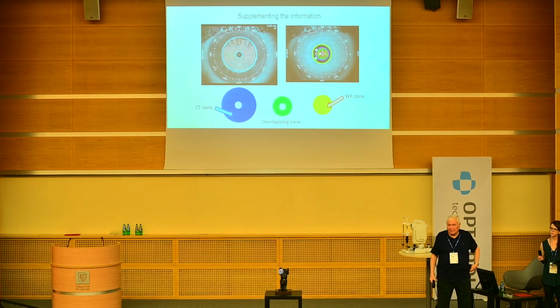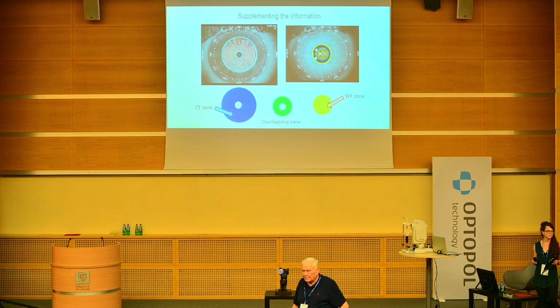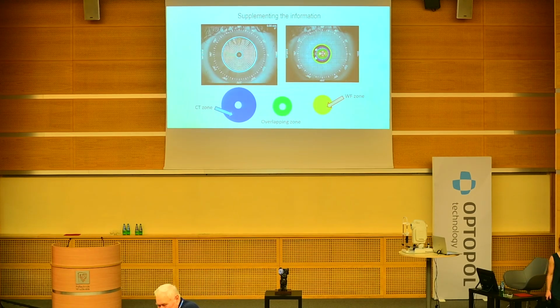Vasyl, I'd like to follow up on that question. If you look at the sampling points across the pupil, they're very simple. And if I had a 10 millimeter pupil, are you saying that you're expanding the Zernikes? That's very dangerous. You can downsize to smaller pupils, but going up without any sampling information, you really don't have information. Why is it dangerous? It's the wrong answer. You have no data to check to see if you're getting the right answer.